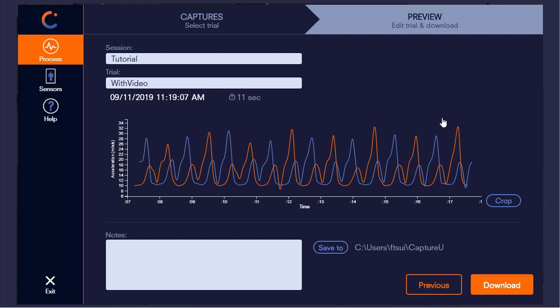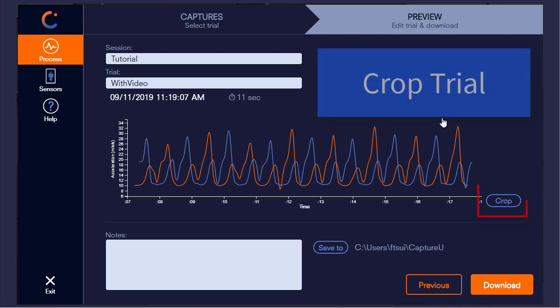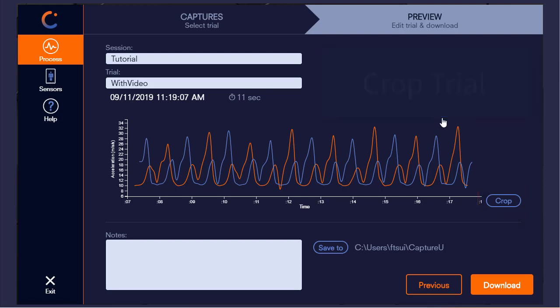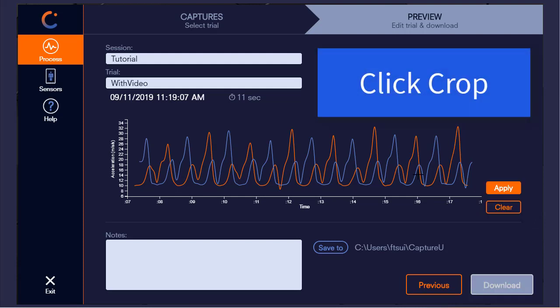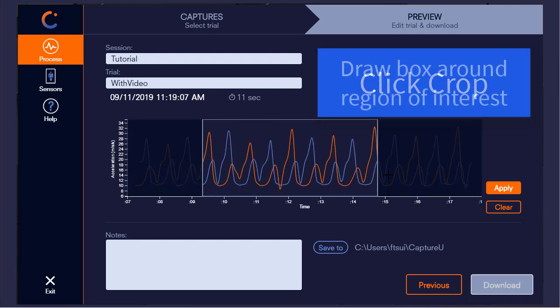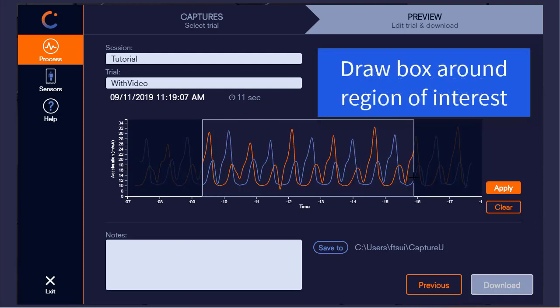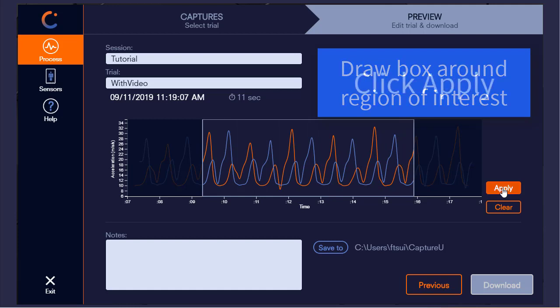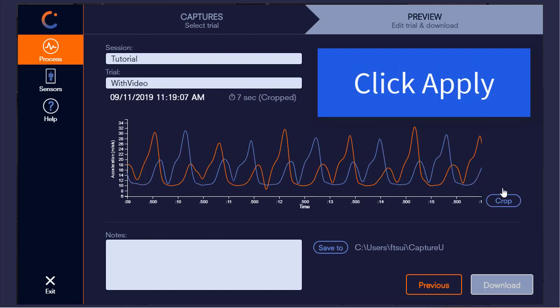To the right of the graph, we have the option of cropping the trial so that we only download a customizable region. Click crop, and then draw a box around the region of interest. When finished, click apply.